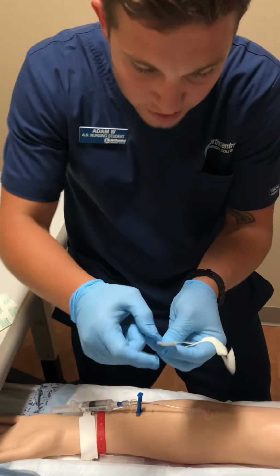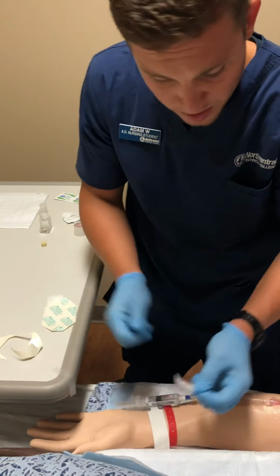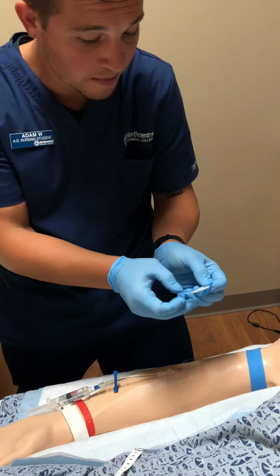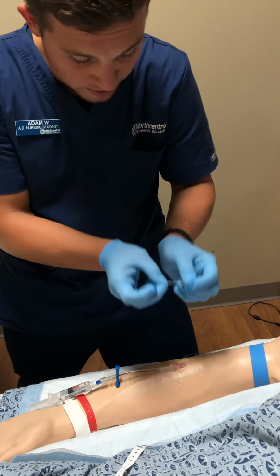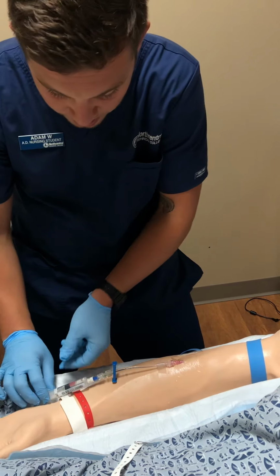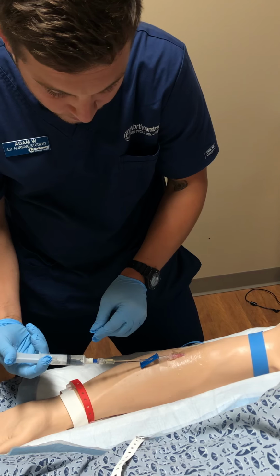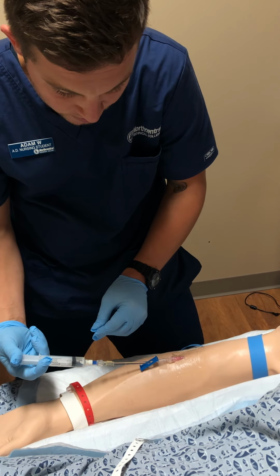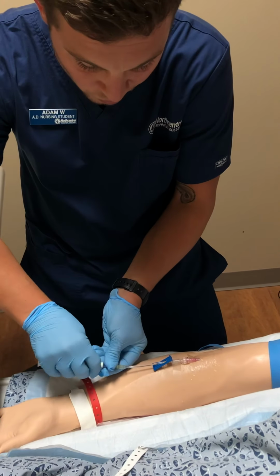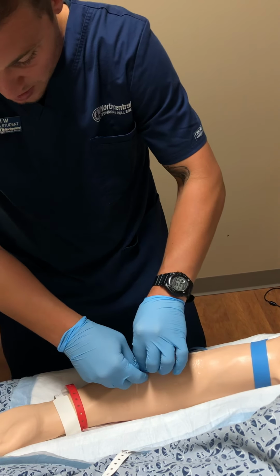And so there's a little piece on here that we put our name on. We got that. Got my initials, the time, the date, and the gauge here is 20 gauge. So we're gonna put that on. All right, we're gonna finish flushing now. Nice and slow. Okay. All right. Gonna lock this here.